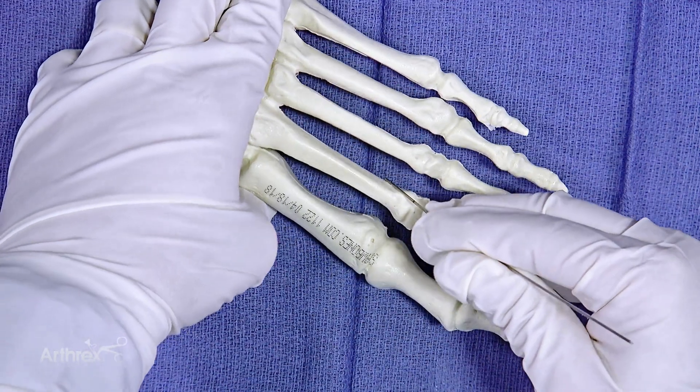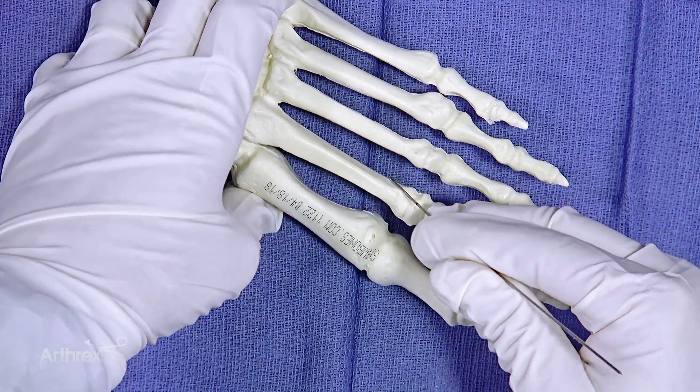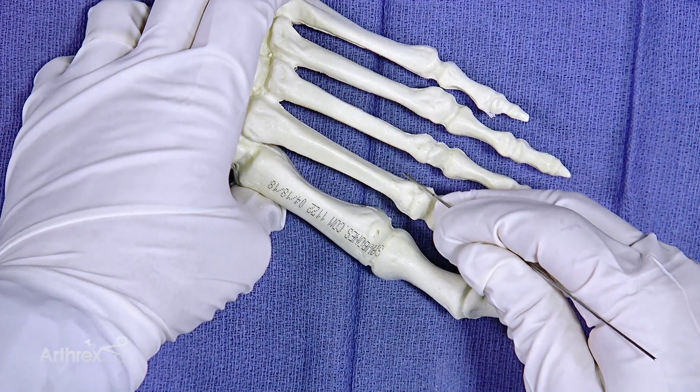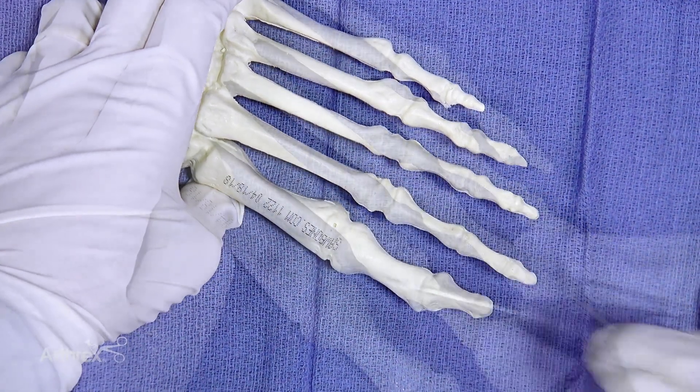This osteotomy is extracapsular, extracarticular, and it's mainly used in cases of severe metatarsalgia in the elderly patient, or in diabetics with plantar ulceration.